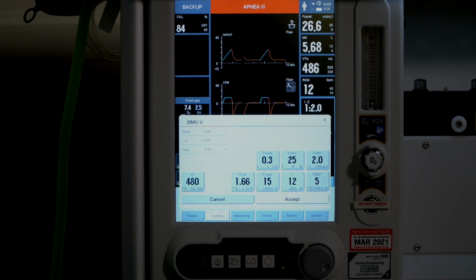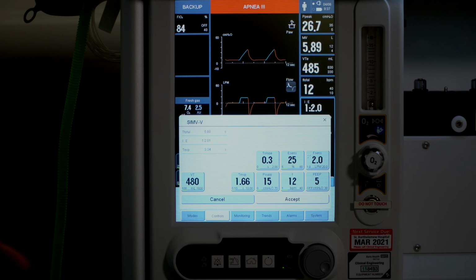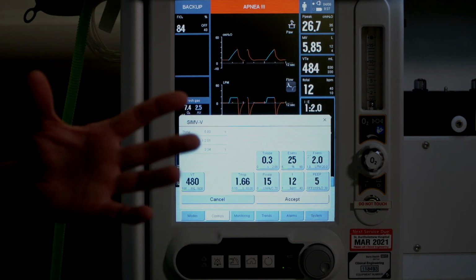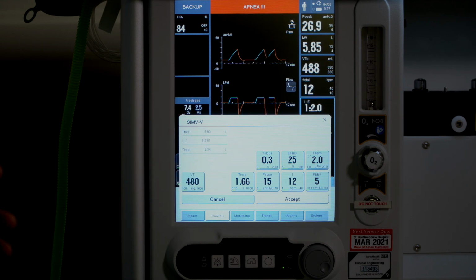You'll see as well that you set the inspiratory time rather than the IE ratio for the mandatory breaths. That's important because, unlike a Maquet, where if you try and breathe during an inspiratory mandatory breath, you can't do that here. You can only breathe in the expired portion. So the machine will give you 12 breaths, whether you're breathing at 20 or whether you're breathing at 6. You will always get 12 mandatory breaths.